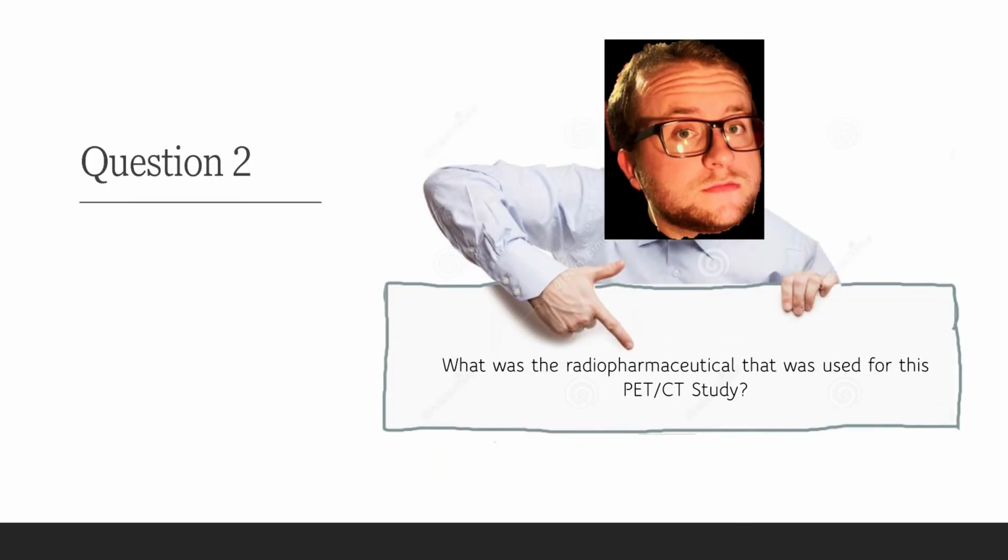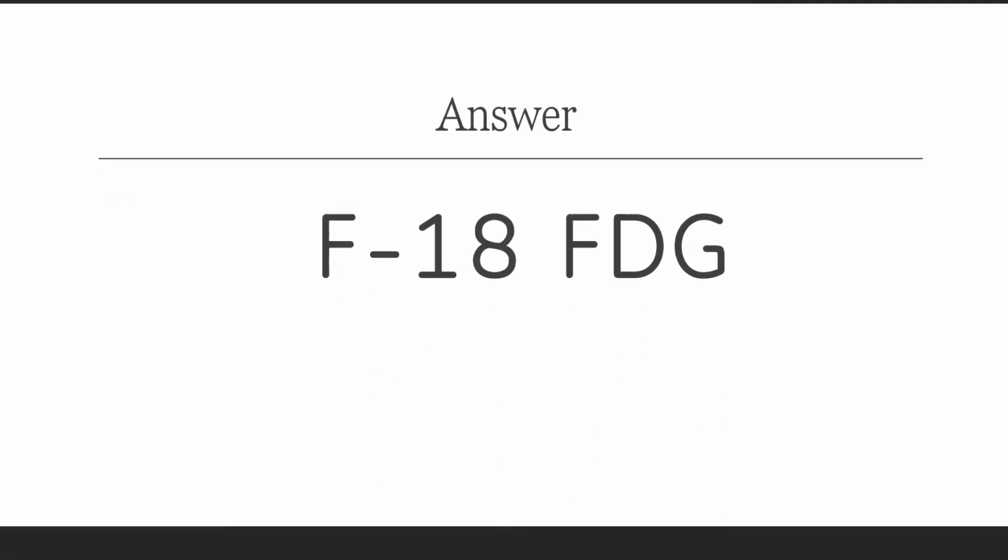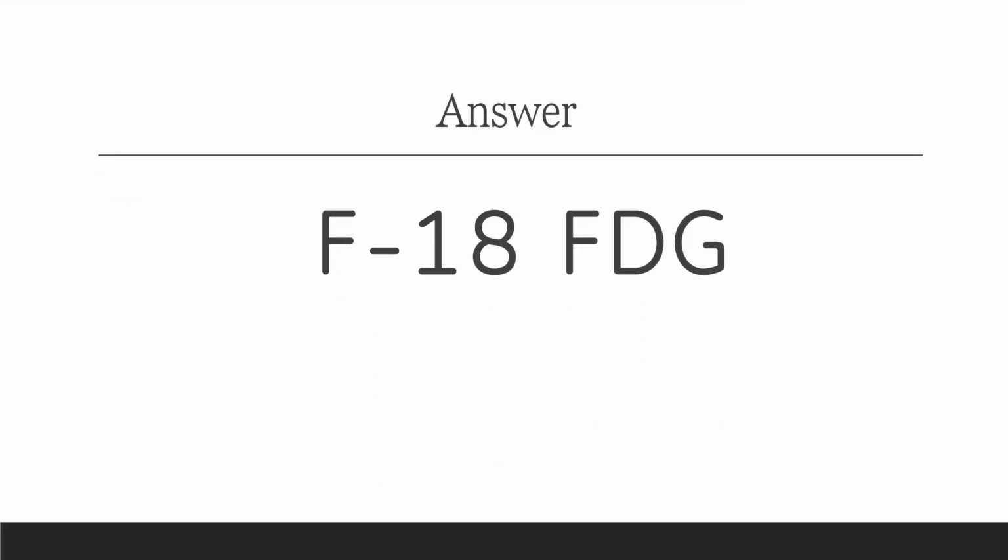Which brings us to our second question. What was the radiopharmaceutical that was used for this PET-CT study? F18-FDG. Follow-up question. What does FDG stand for? Fluorodeoxyglucose. Good job.